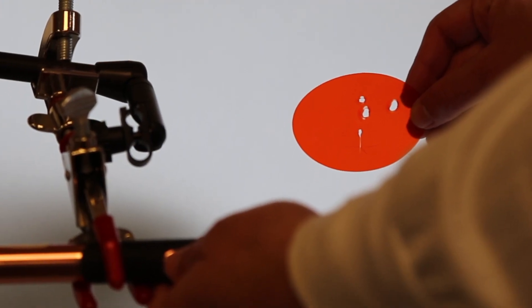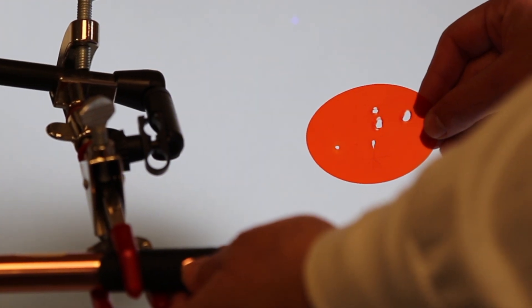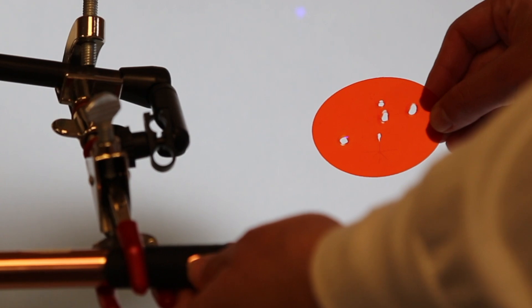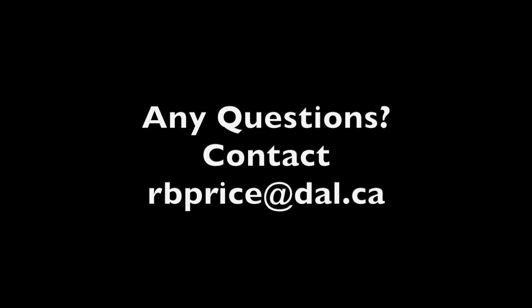Just look how it burns a hole through the orange plastic. Just imagine if that was your eye. So it's really important to follow the manufacturer's instructions and use appropriate eye protection when using the Monet.